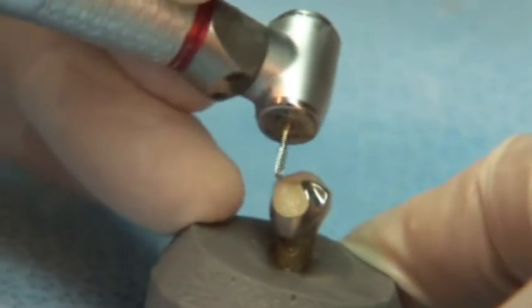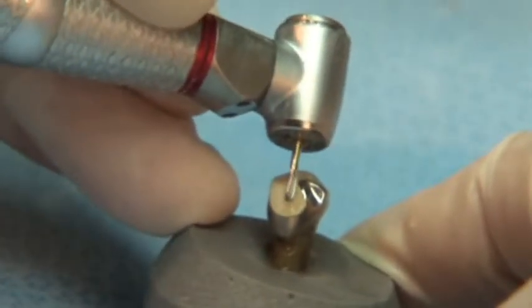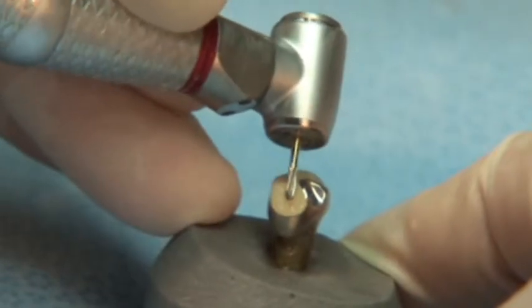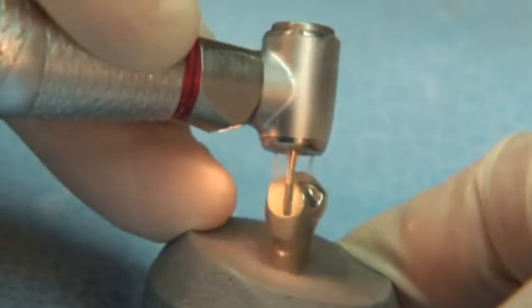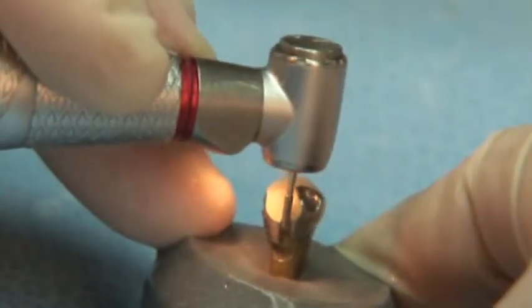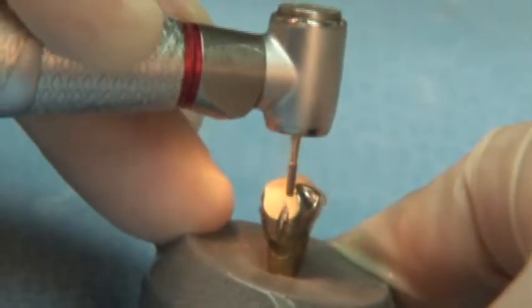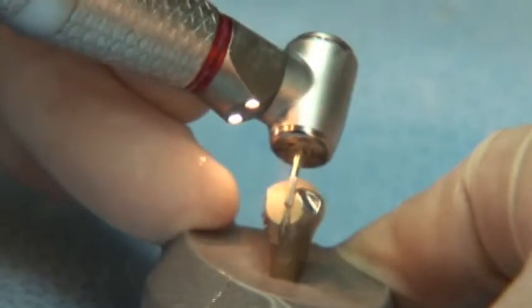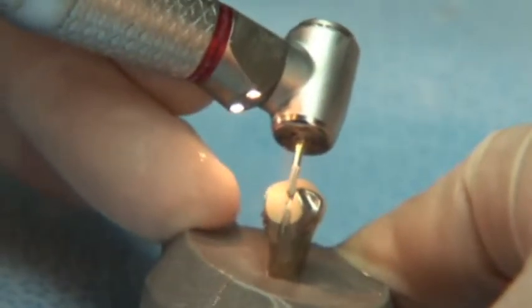By design, the Great White Series offers faster cutting and less vibration to efficiently cut slots through any metal crown. The Great White Number Two burr cuts through both porcelain as well as the metal substructure with great efficiency.